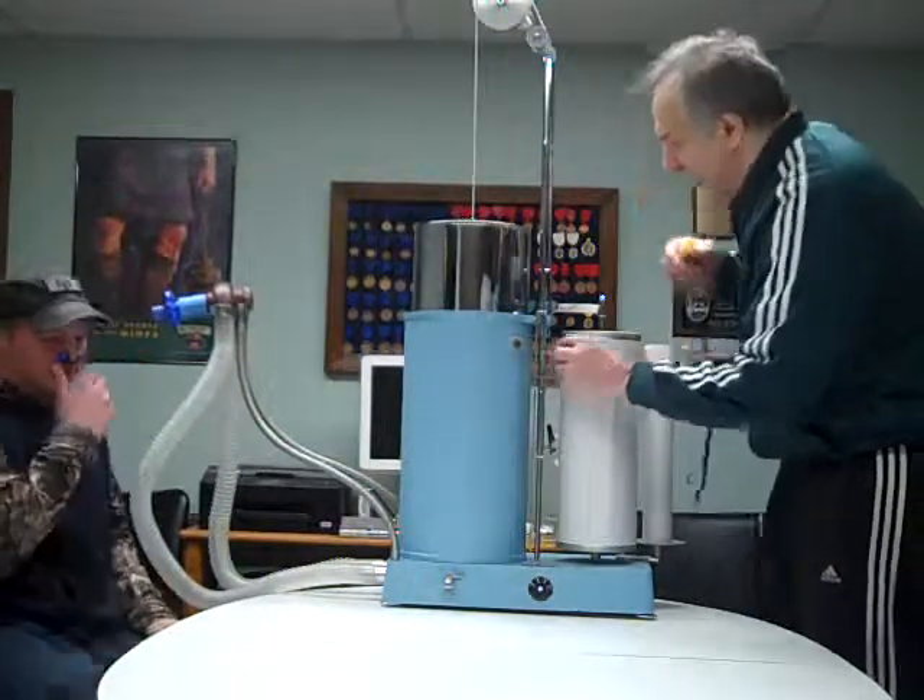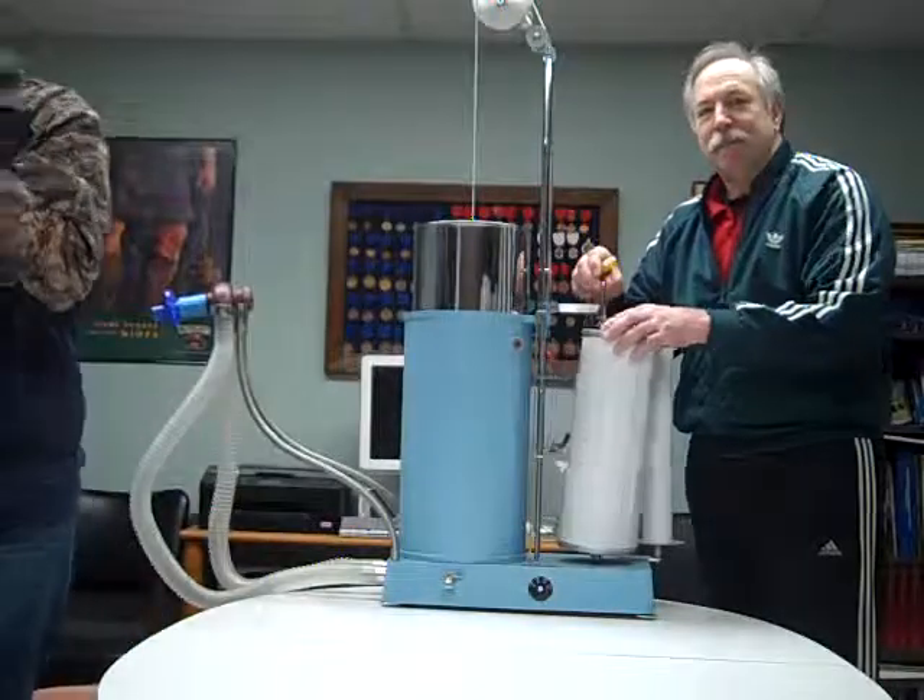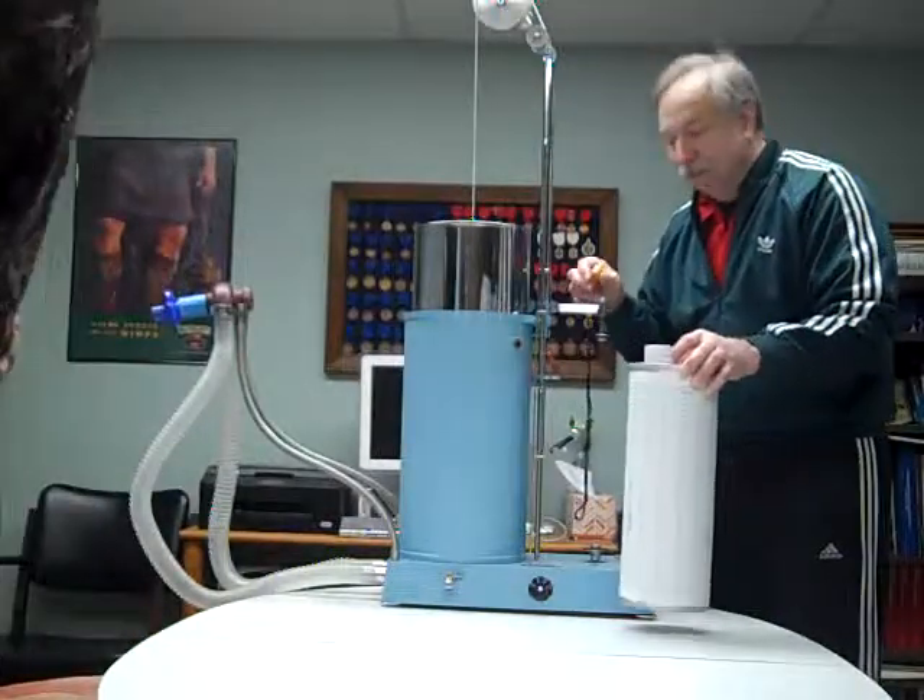Okay, and we hit that and we got it. That would be our max MVV test.